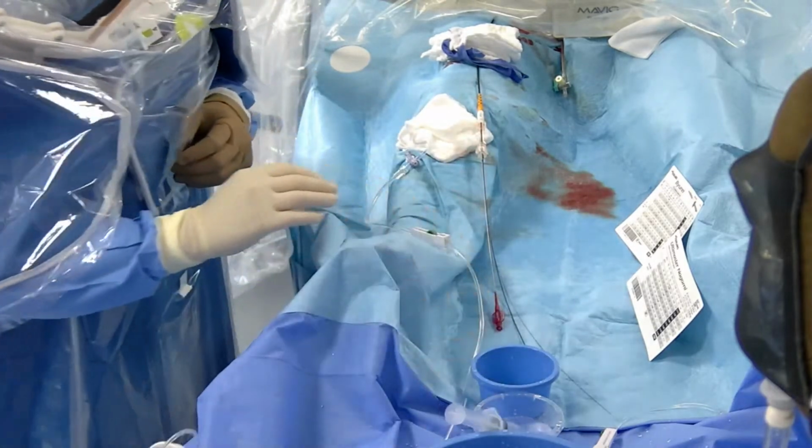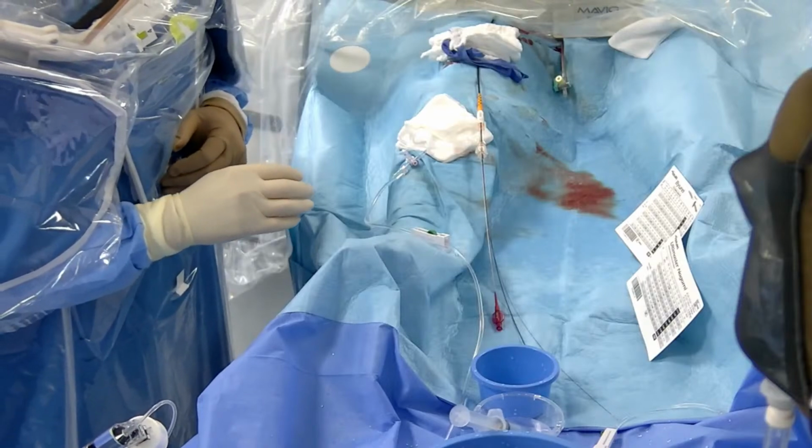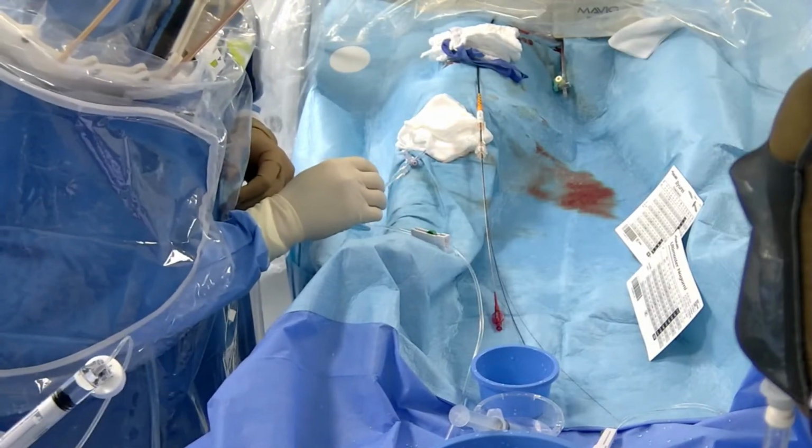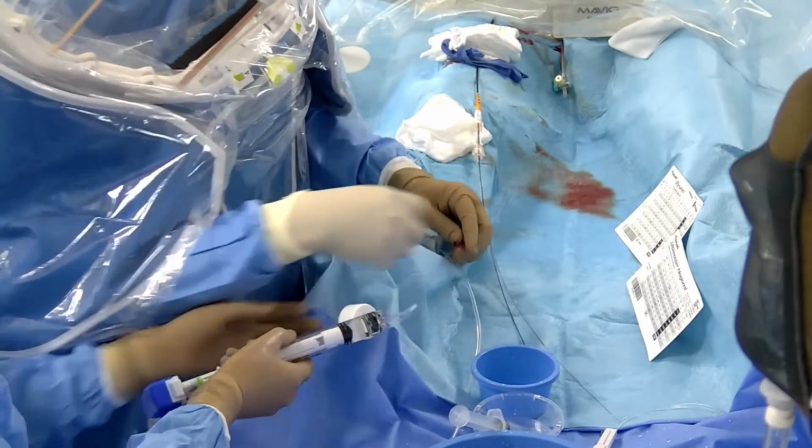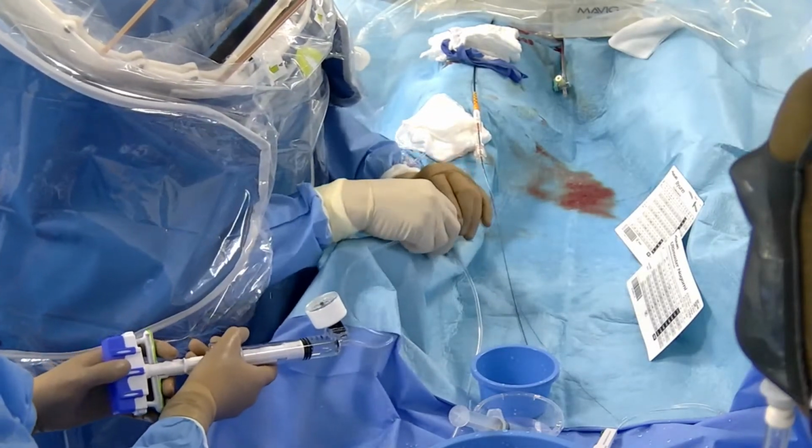Now it's in the exact position. We can take the stand. I think it's okay. This is a very useful technique.